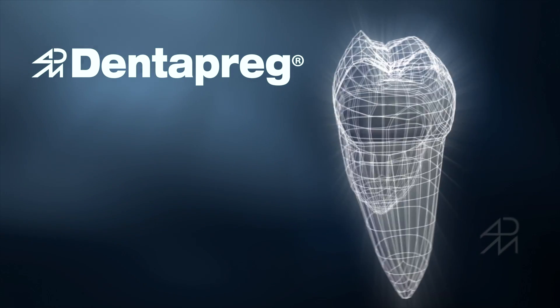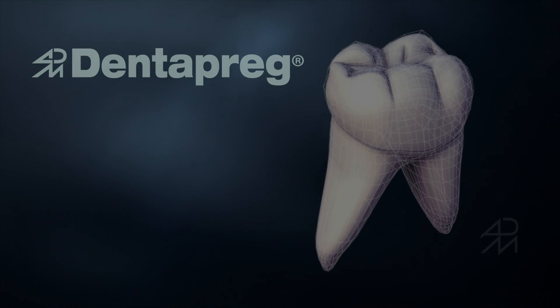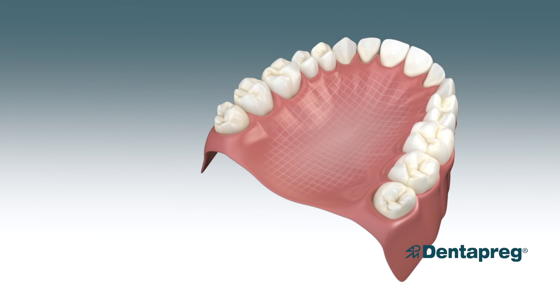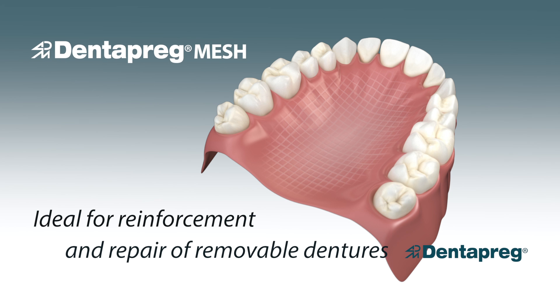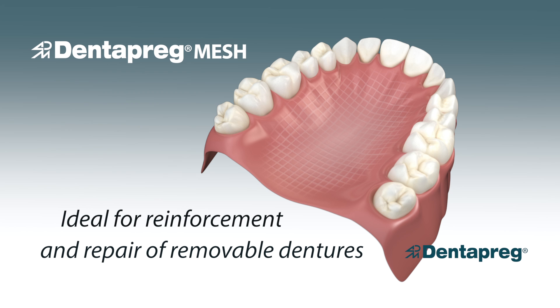Welcome to this Dentepreg instructional video. In this video, you will learn how to quickly reinforce removable dentures with Dentepreg Mesh. Dentepreg Mesh is a revolutionary product that brings new opportunities in reinforcement and repair of removable dentures.